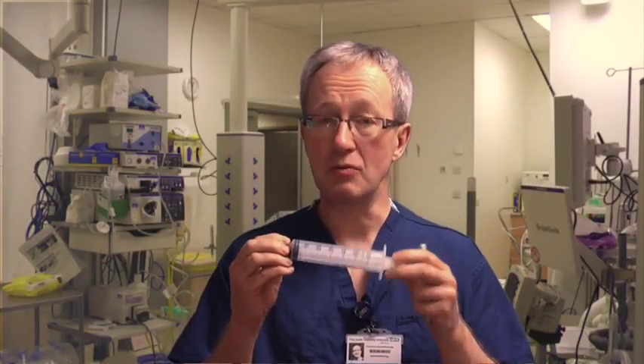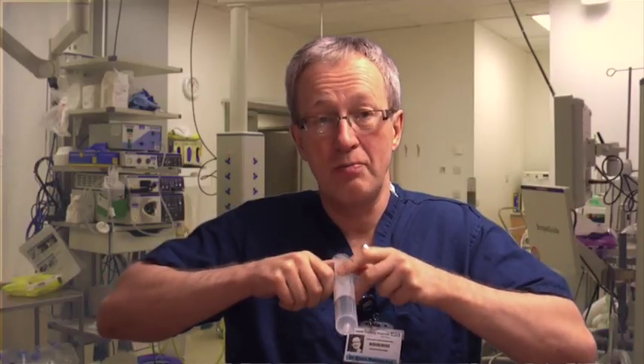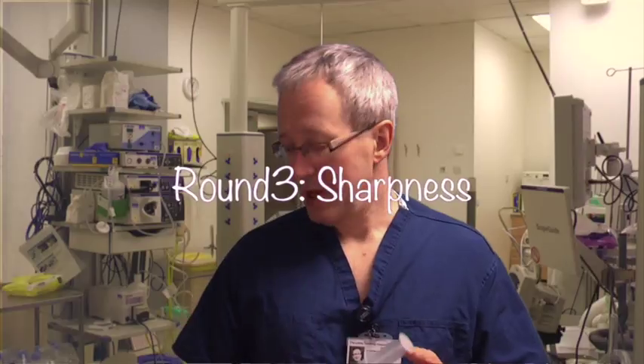Round two: flow rate. I filled a 50ml syringe with 30ml of water and measured how long it took to empty it squeezing as hard as I could with both hands. The US Endoscopy needle — which nurses do struggle with; you can't use anything bigger than a 5ml syringe — took more than a minute to empty 30ml of water. It took just 27 seconds to empty 30ml down the Olympus Needle Master. Round two also goes to Olympus.